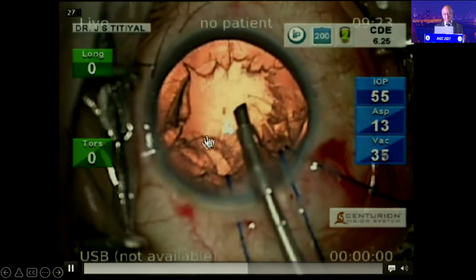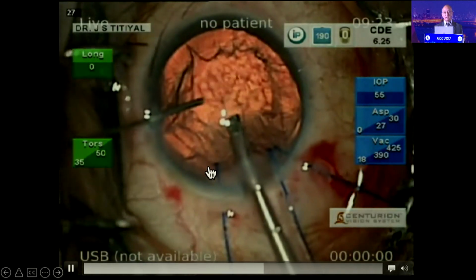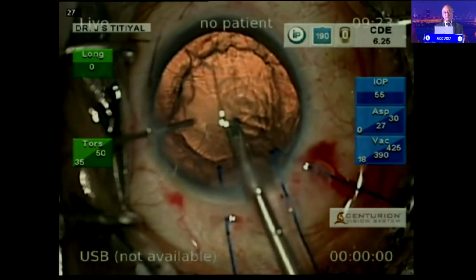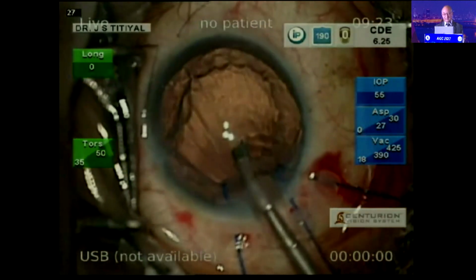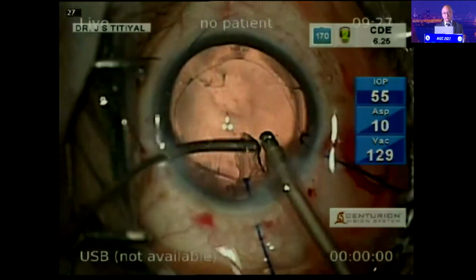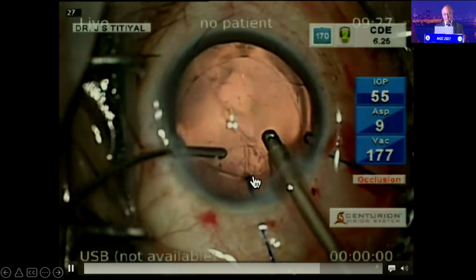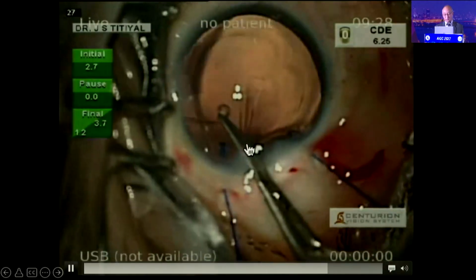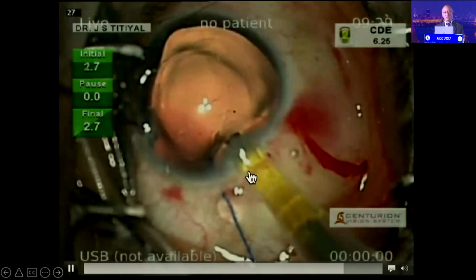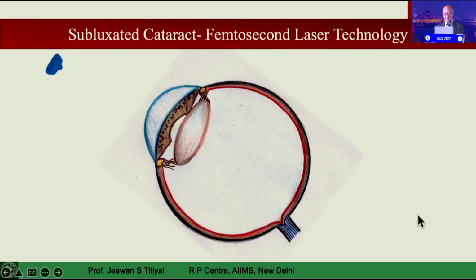Before you take out the handpiece, always fill the bag with dispersive viscoelastic. That will maintain the bag integrity and will not allow sudden collapse of the anterior chamber, which can further damage the zonules. This is classical teaching for all cases where you have weak zonules or a weak capsule. In these cases, we have to maintain that. Always do a bimanual aspiration, especially in areas where subluxation is present, because the cortex is difficult to remove from that area. A little tangential movement will help you. The CTR has been put here. Subsequently, we'll implant the IOL in these cases.